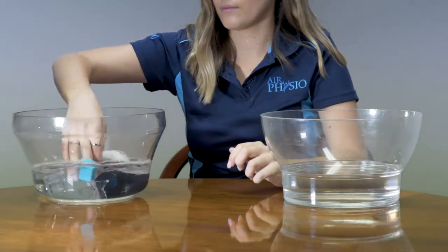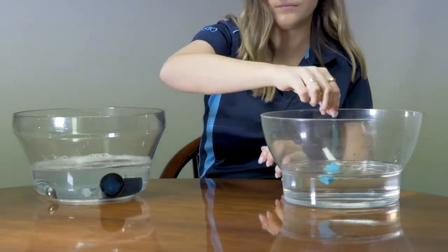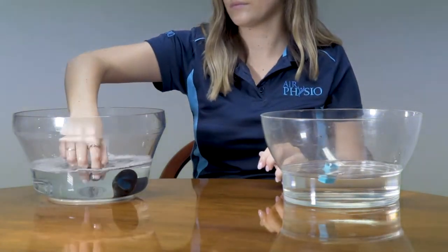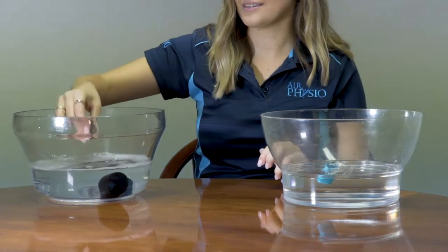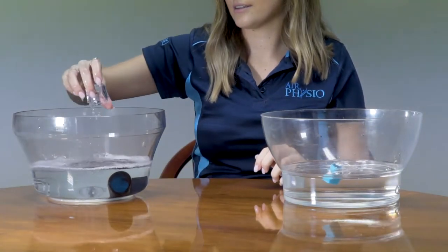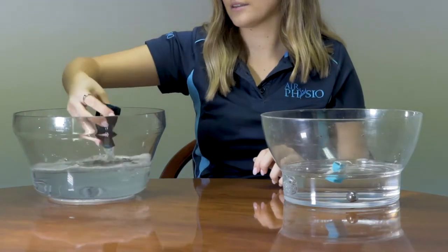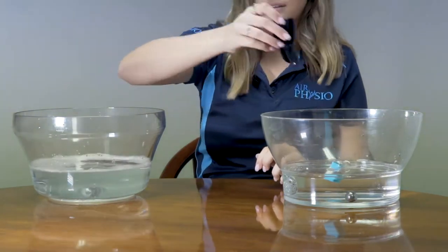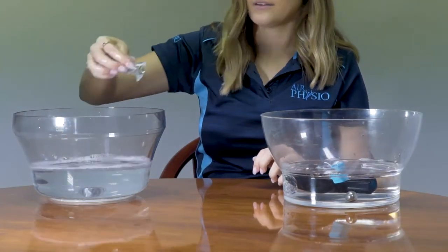Once you've cleaned it, shake each part to remove any excess water and place it into distilled water. The water may be tap water boiled for five minutes or more to remove any impurities. Please do not use water straight from the tap, as there may be contaminants which could affect the hygiene of the device for breathing.